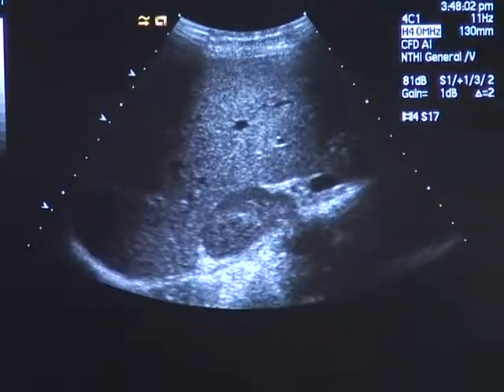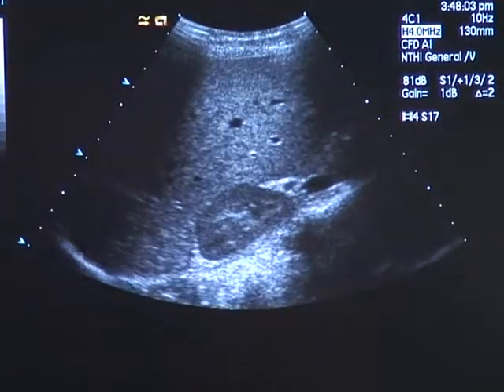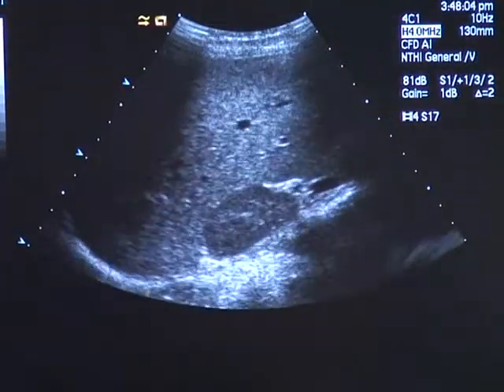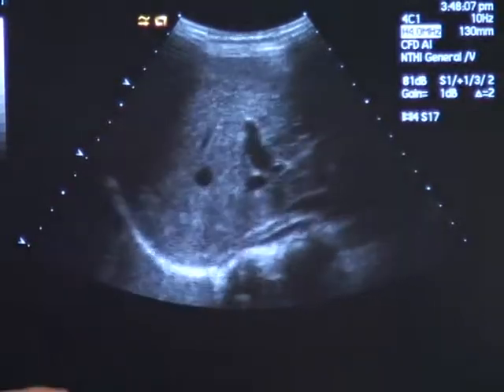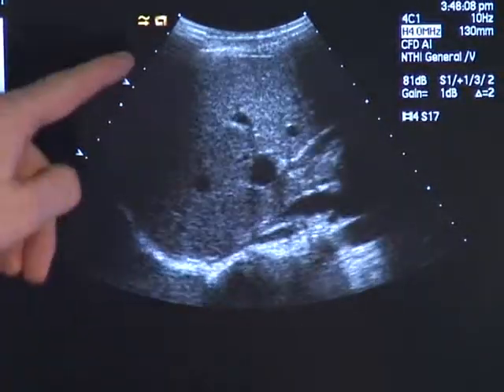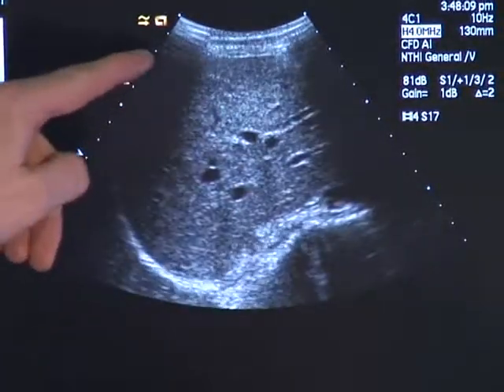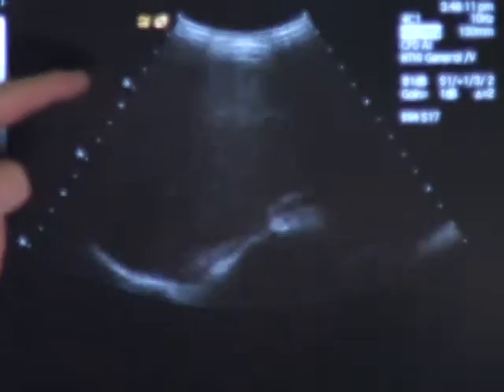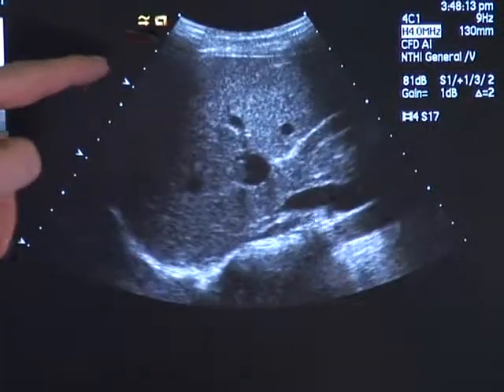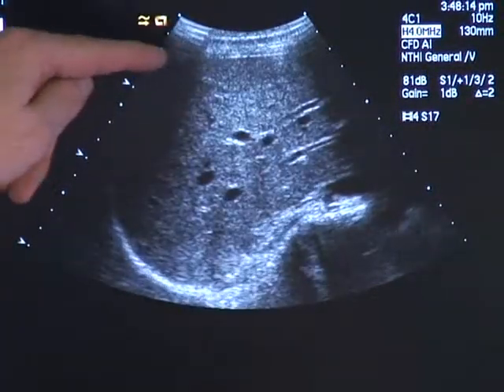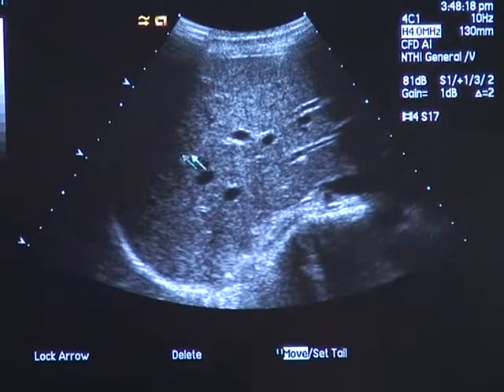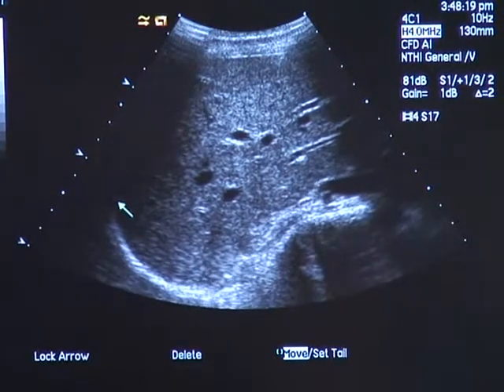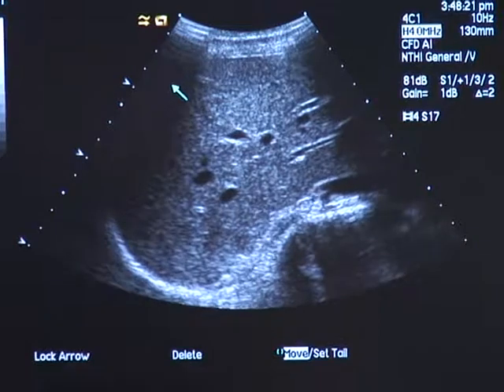Take a breath, inspirate, then stop and don't breathe. Focus on the screen and try to nicely look for the upper part of the right liver lobe.